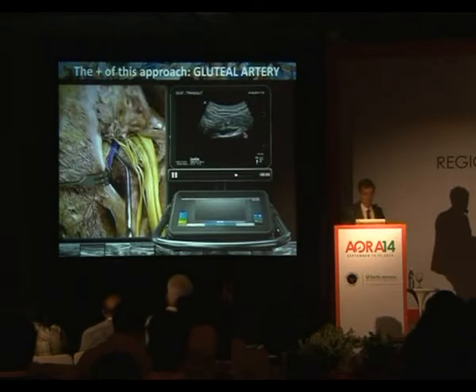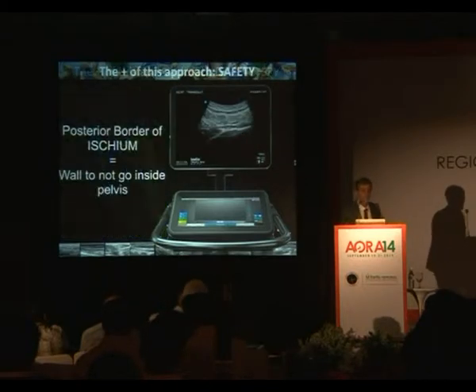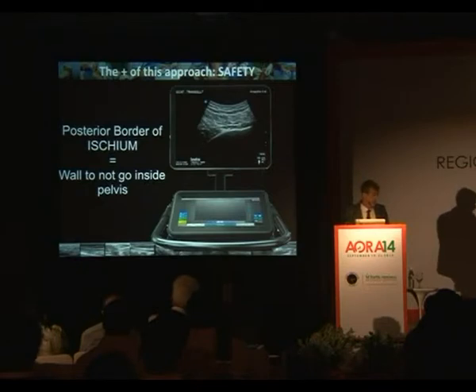You have the pulse here, okay? And you are here, this is the vascular landmark. You have the gluteal artery that you can see, and lateral to the gluteal artery, you will have your sciatic nerve. That is medial, that is lateral. So there is no risk, I told you, because we are at the level of the ischium, so there is no risk to go inside the pelvis.